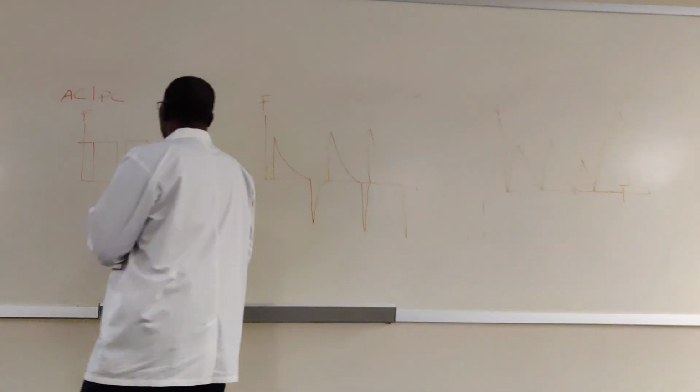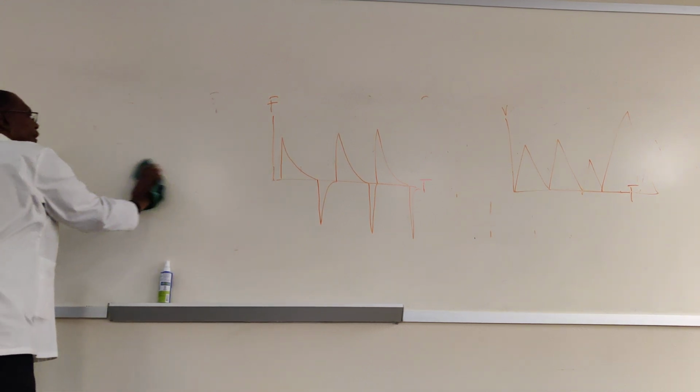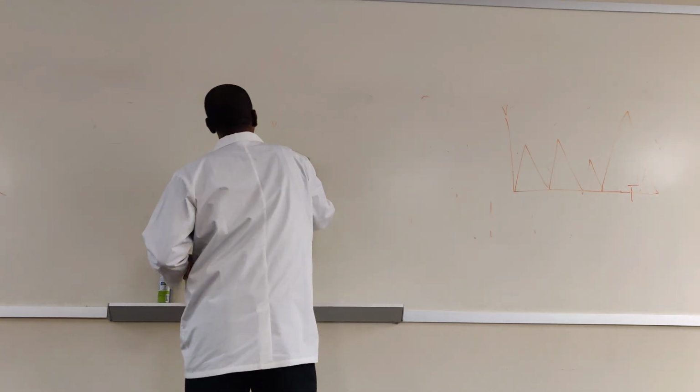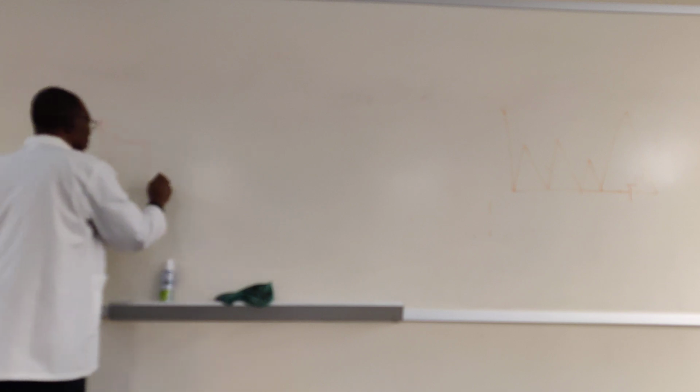And then there is, when you say too much rise time, so if you look at your pressure time curve and you see something like this, like that.